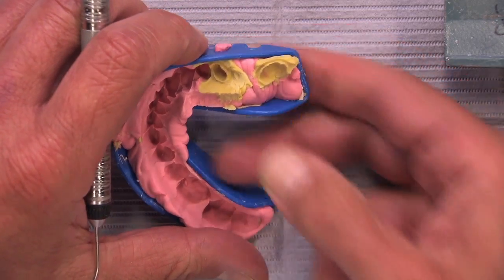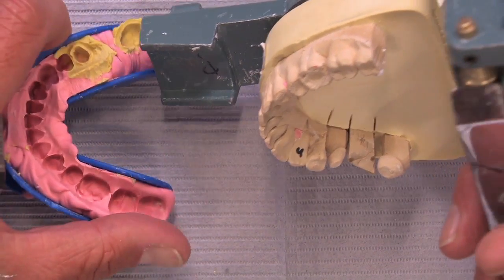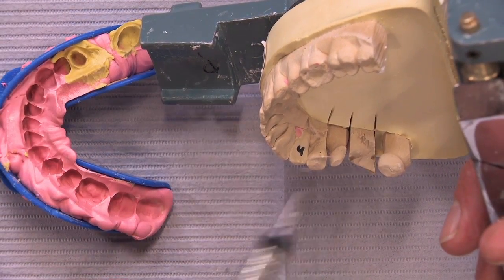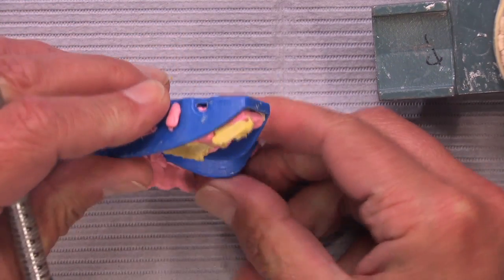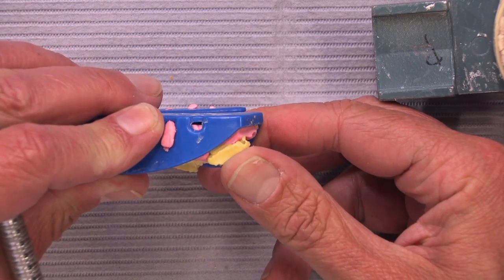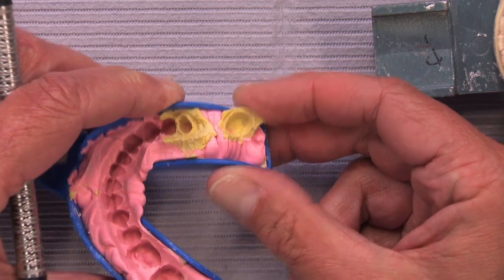This tore off actually when it was poured. If you look at the model on the lingual of that molar, you can see it is in fact actually here. So that thin little fin of material came off when it was poured. But you can see from the outside that we still have kind of a weak impression here because we don't have any of that tray material to the outside of this.